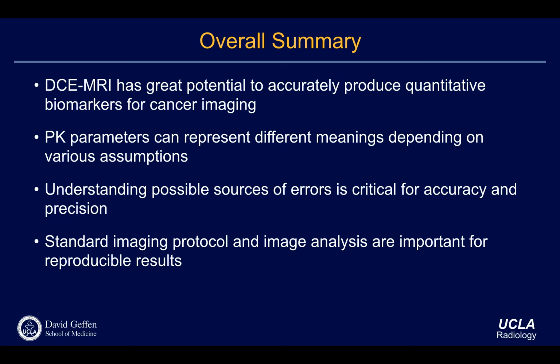So nowadays, people are interested in whether, since we have developed a lot of quantitative biomarkers, they are really reproducible and repeatable across multiple vendors and scanners. For example, even with Siemens, at UCLA we are a big Siemens site. We have 18 different scanners, but they're not the same types. Some scanners are 10 years old, some are from 2017. MRI scanners are expensive, so the hospital cannot buy all new scanners at the same time. Some are really old, some really new, so there's heterogeneity. One has better performance, the other doesn't.